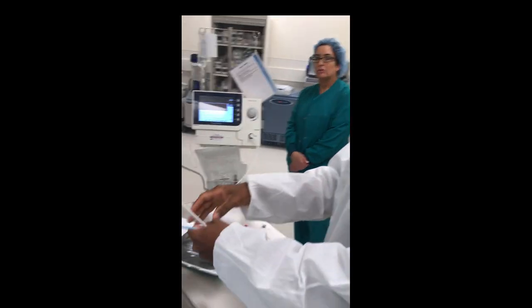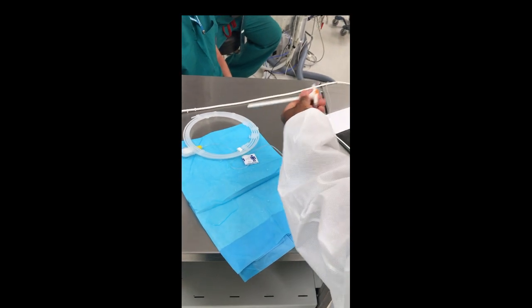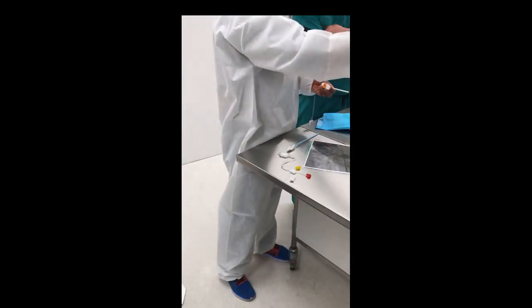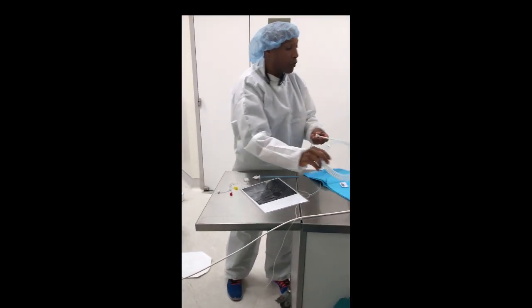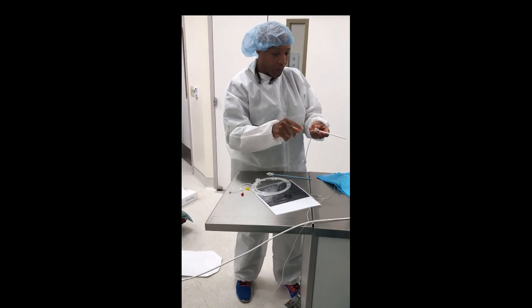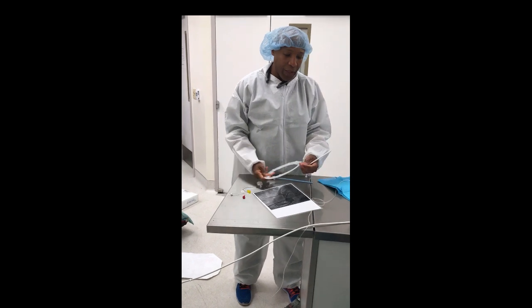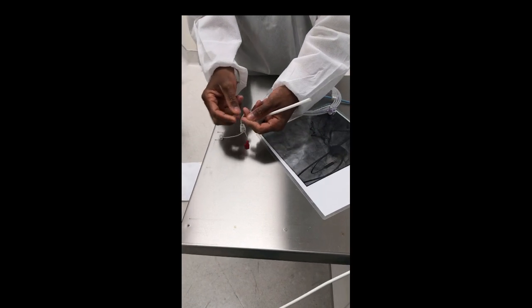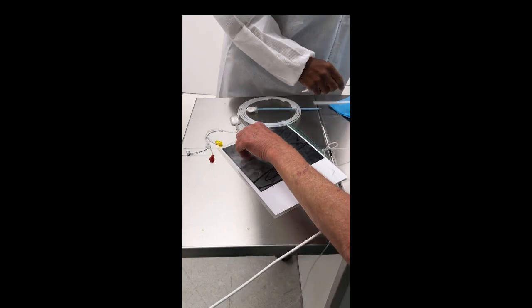You're going to help the doc take the 6-French sheath and upsize it with dilators to a 14-French sheath. Pull the dilator and give heparin. Then take an angled pigtail and put it through, up and around into the body on a J-wire. Once the pigtail is in the ventricle, exchange the wire — pull that 0.035 wire out and put the stiff 0.018 wire in.